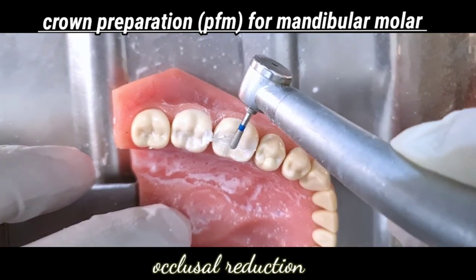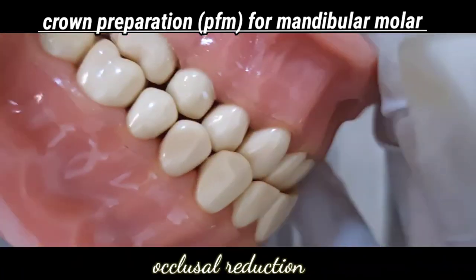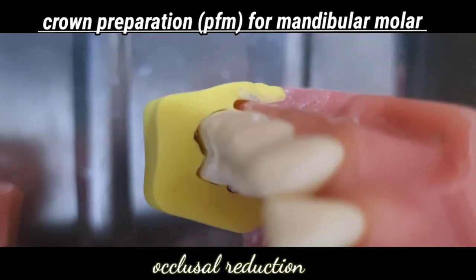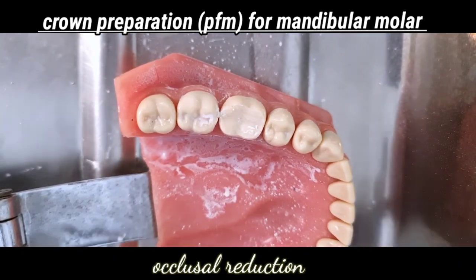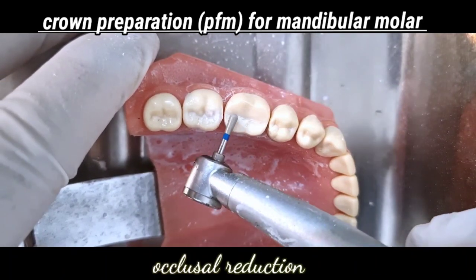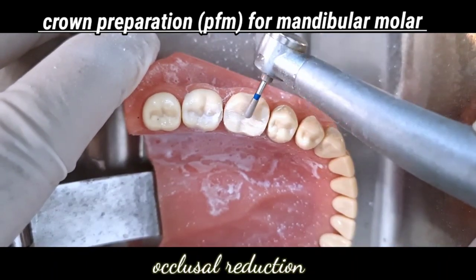A prepared tooth should look like a miniature of the original tooth. We are following the previous anatomy of the teeth while doing all the reduction with minimal tapering. So a prepared tooth looks like a tiny version of the original tooth. An overall reduction of 1.5 mm is done, which is equal to the non-functional cusp bevel. First an overall occlusal reduction is done, and then later we do the functional cusp bevel.